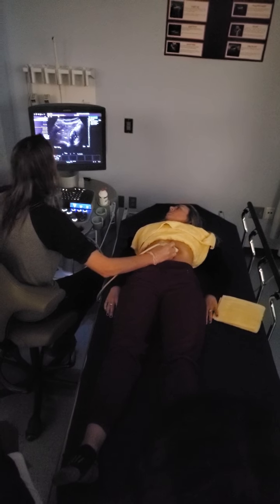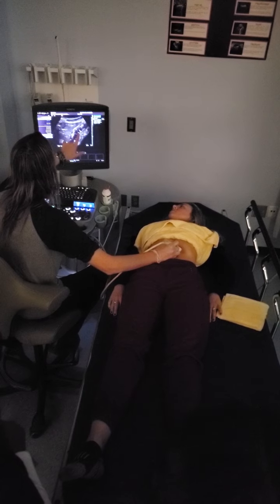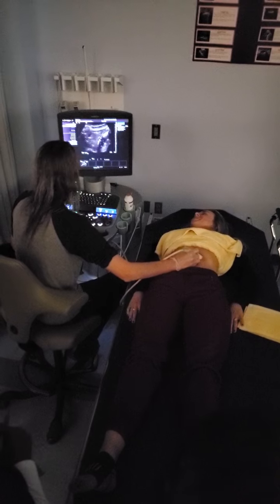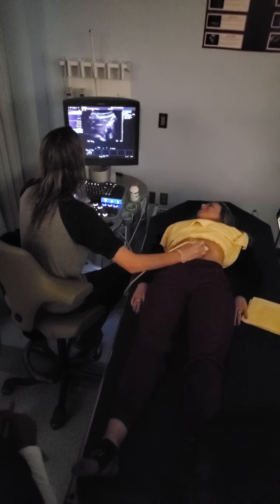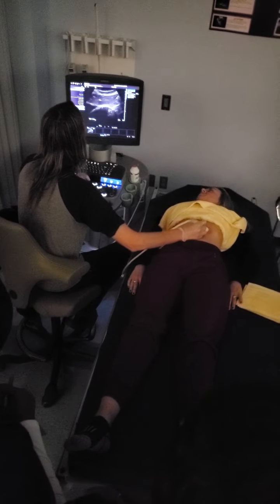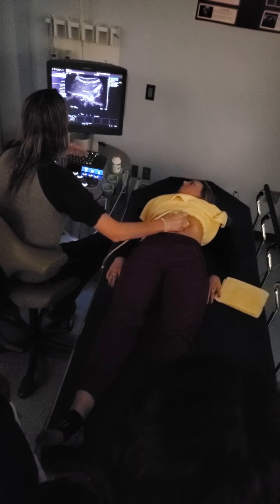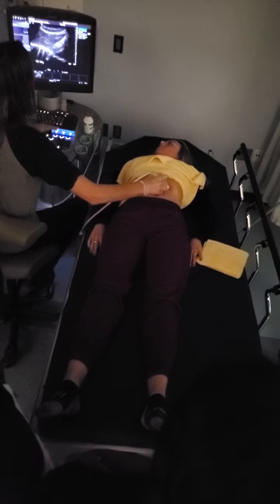Okay, good. And then this is stomach, right in here. We're seeing some water maybe, little bubbles. What's that? That's okay. Okay, so big breath in. Here we are. We're at the superior portion. I'm angling my transducer inferiorly and laterally to her left side.